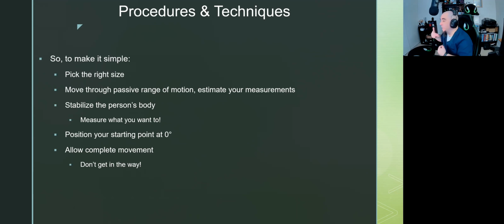So you may have to stand at their head in order to get an effective abduction measurement, which is why it's good to stand on a table that you can actually move around in.